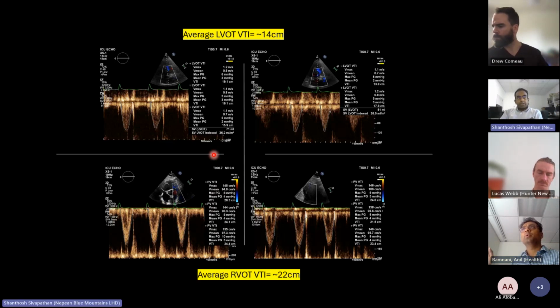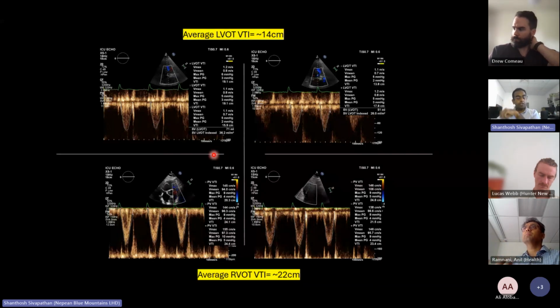I don't really think it makes a difference. In clinical practice we don't wait for them to change parameters. There are subtle variations, so if you see a significant difference, you take an average of at least 5 measurements to even it out. Otherwise, most of the time, sonographers will not be waiting around for the respiration phase.